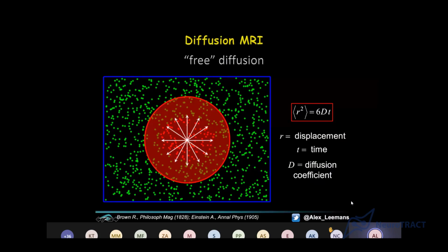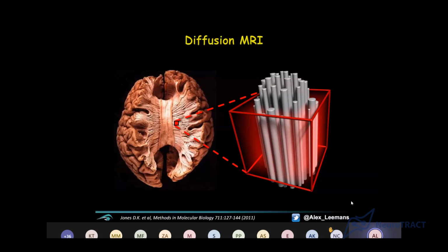So the cool thing is that this diffusion process can be described, you can put a formula to that. And as physicists, we love formulas, obviously, but it gives us a hold to compute things, to predict things. And this is going to be important later on. Okay. And like I mentioned before, this drop of wine in a glass of water, it also works for a drop of water within a glass of water. So we call it self-diffusion.